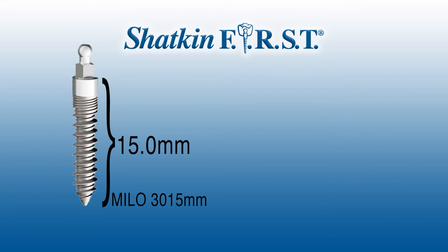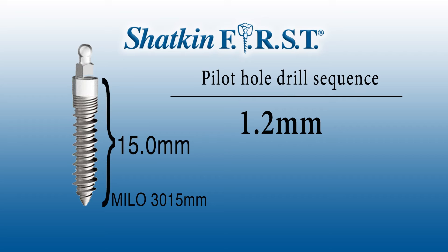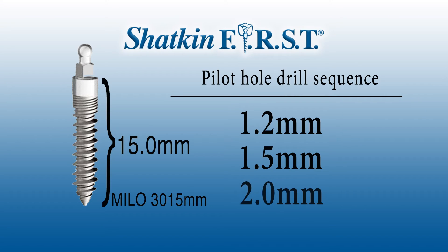Let's talk a little bit about the larger implants, because the 1.2mm pilot drill is used for the 2.0 and 2.5 implants only. If you're going up to a bigger implant like a 3.0, a 3.7, or a 4.2, you need to use a bigger pilot drill. For the 3.0mm Milo O-ball implants, we're going to start with a 1.2, then go to a 1.5, and sometimes to a 2.0. It depends on the density of the bone — if it's denser bone, you'll go to a larger diameter pilot drill. Typically in the maxilla or posterior mandible using a 3.0 Milo implant, you'll use up to a 1.5, and sometimes a 2.0 pilot drill.